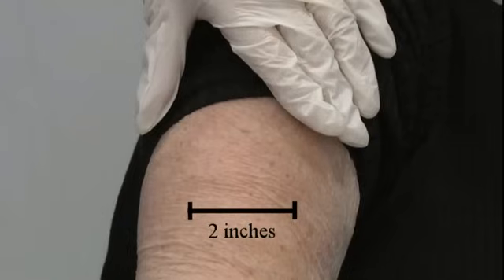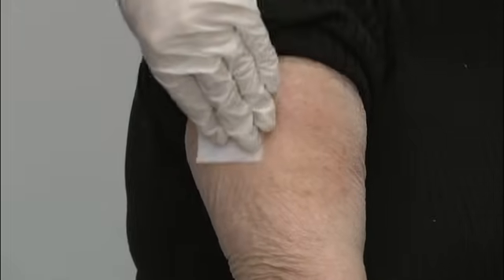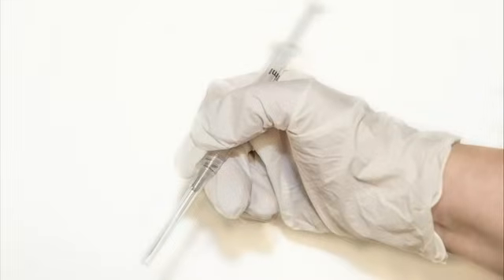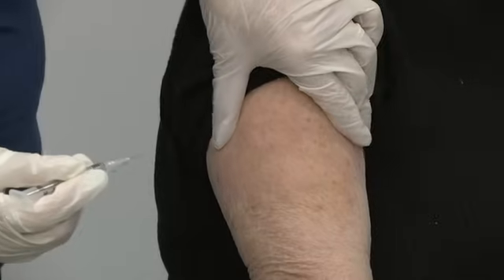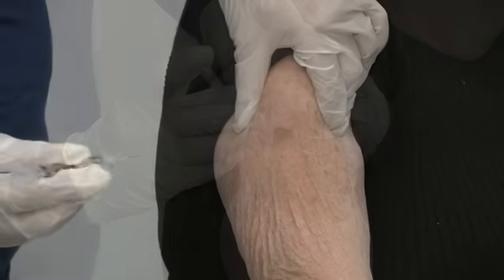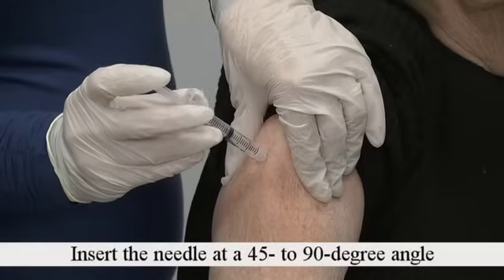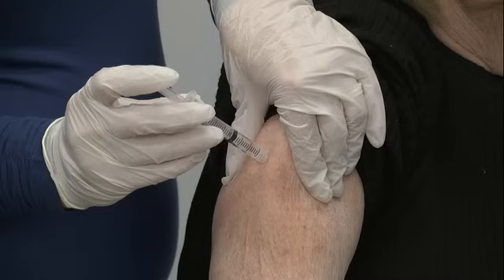The injection site is about two inches of skin. Clean this area in a circular motion with an alcohol wipe. Using the hand that you write with, hold the syringe like a pen or pencil with the needle end down. Remove the needle cap. With your other hand, pinch about two to three inches on both sides of the clean skin. Insert the needle with a quick motion into the pinched skin at a 45 to 90 degree angle. The needle should go all the way into your skin.